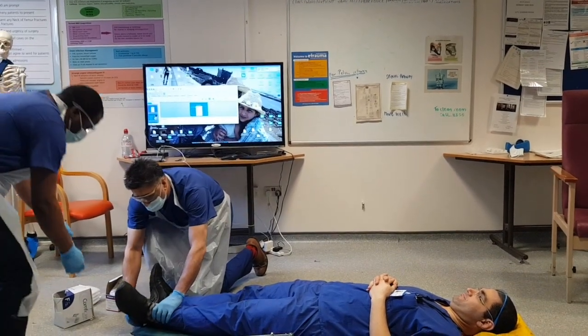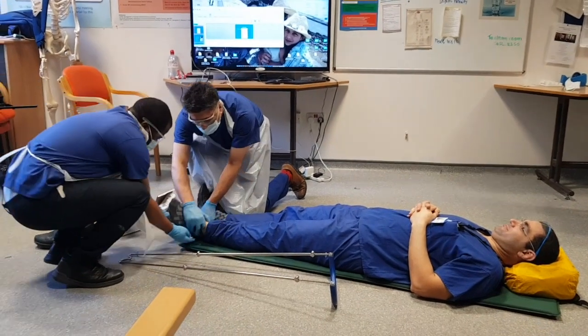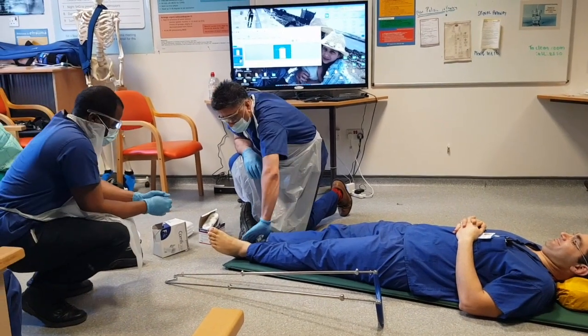First thing that we're going to do is make sure that he's neurovascularly intact before we start. I'm going to take off his shoe and sock, and then check that he's got pulses. And he has.